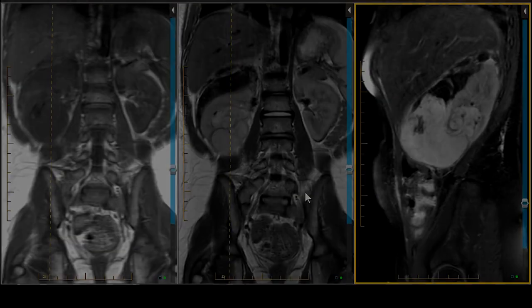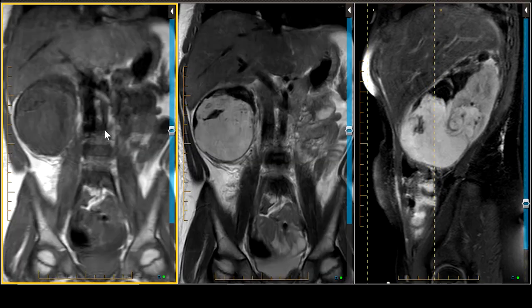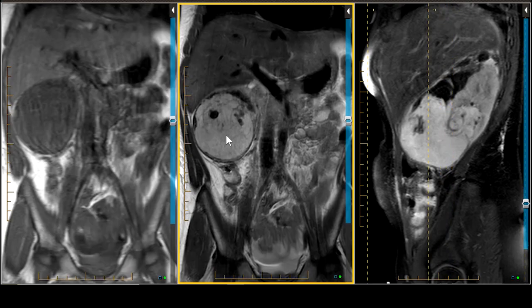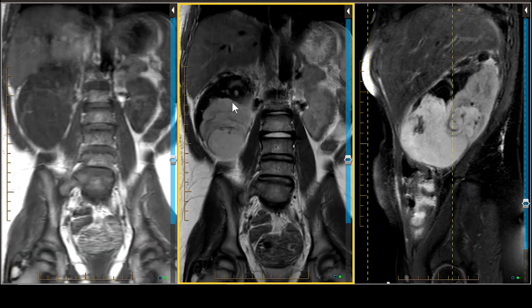I'm Dr. Steven Pomerantz talking about pediatric renal masses. I have a five-year-old whose parents incidentally discovered an abdominal mass while playing with their child. On the left is a coronal T1-weighted image, in the middle a coronal T2-weighted image, and on the far right with exuberant fat suppression is a sagittal T2 fast spin echo image. Scrolling through, there is a large mass in the right mid-abdomen associated with the right kidney, with several components.